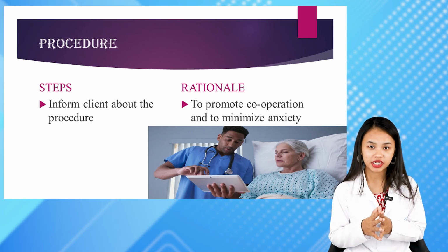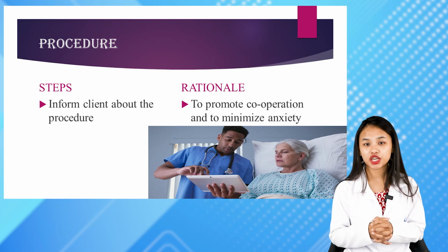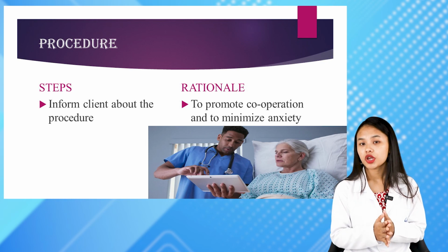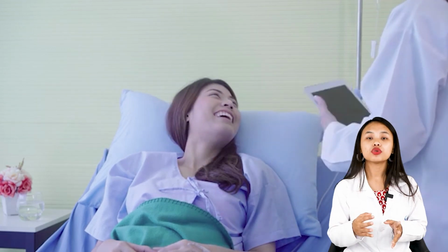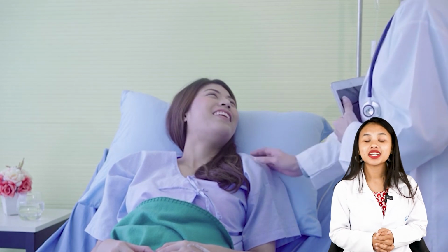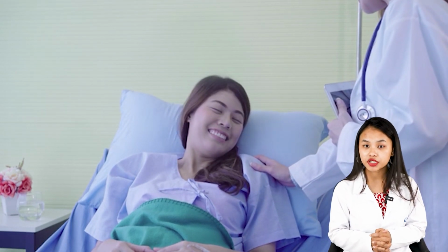Once the equipment has been arranged, and the preparation of the patient and the environment is done, then you can start off with the procedure. The first thing that we must do is inform the patient about the procedure. As I have told you, by doing this, it will help to enhance their cooperation. So, educating the patient or telling them why this procedure is being performed is very important.